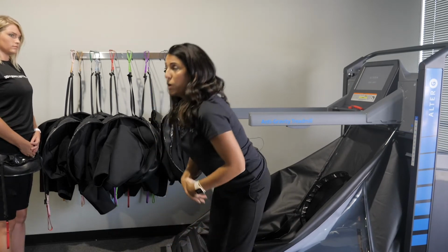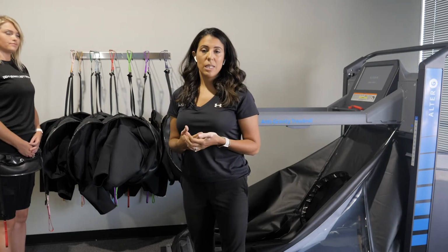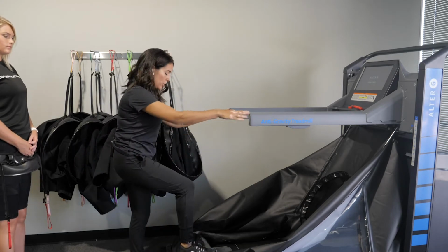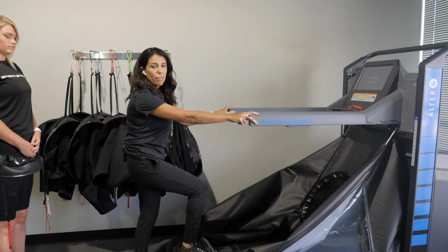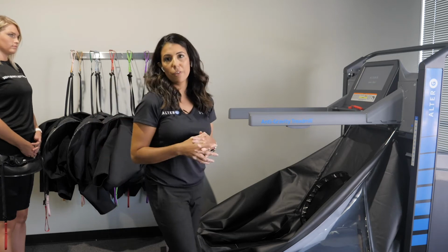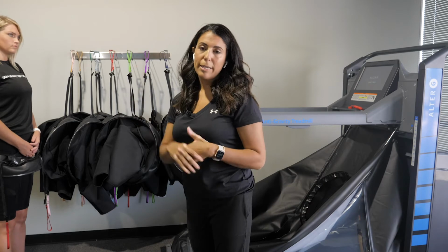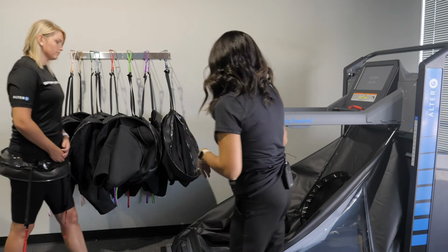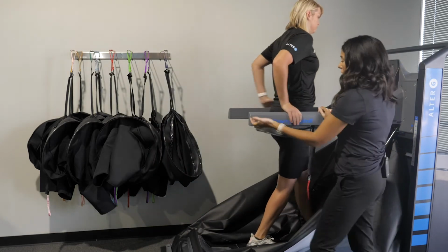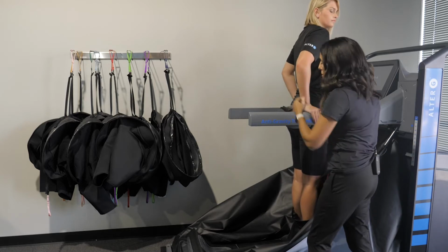If you're working with a patient who's in a wheelchair, you can simply do a sit to stand directly from the wheelchair. So we can pull the wheelchair up, already put the patient's feet on the treadmill, and then simply have them use the handrails to stand up. So there are a variety of ways to get patients of different levels onto the machine, and it is much easier now, again, with the lower step height. So we'll go ahead and get on in. It's important to hold on to the handrails. You have that nice support. You can also always hold on to the shorts from the inside if you want to help stabilize your patients.